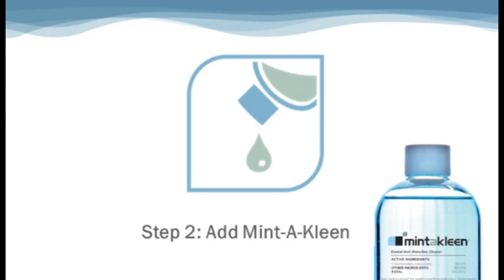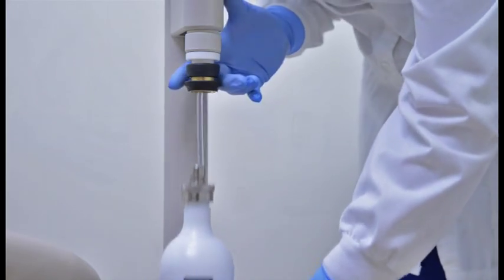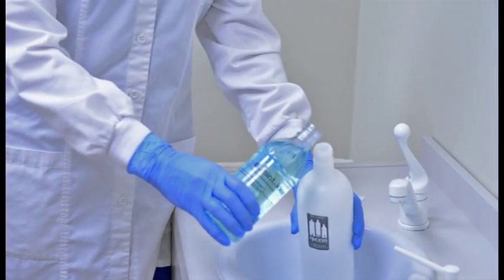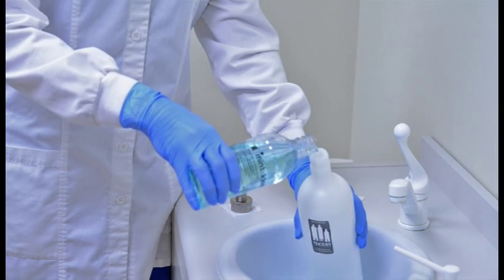Now we are ready for step two, add the Mentoclean treatment. Turn the dental unit off and remove the water bottle. Pour just four ounces of Mentoclean, or one-fourth of the bottle, into your heavy-duty water bottle.